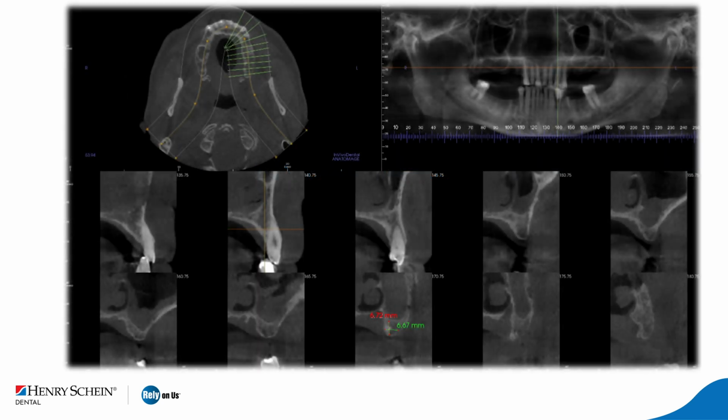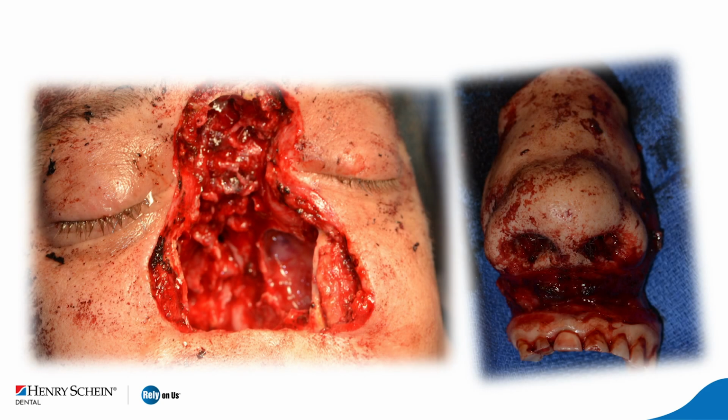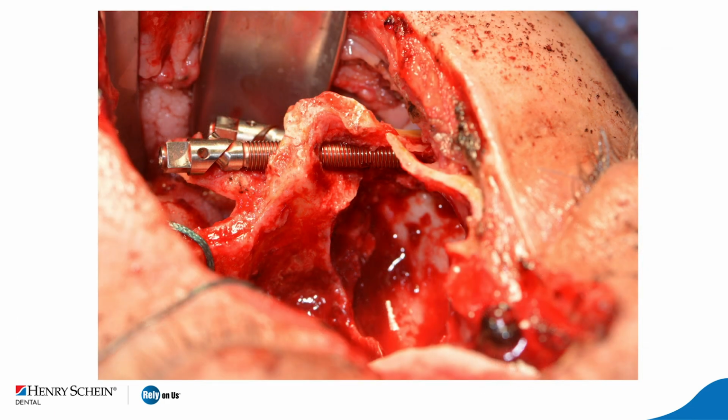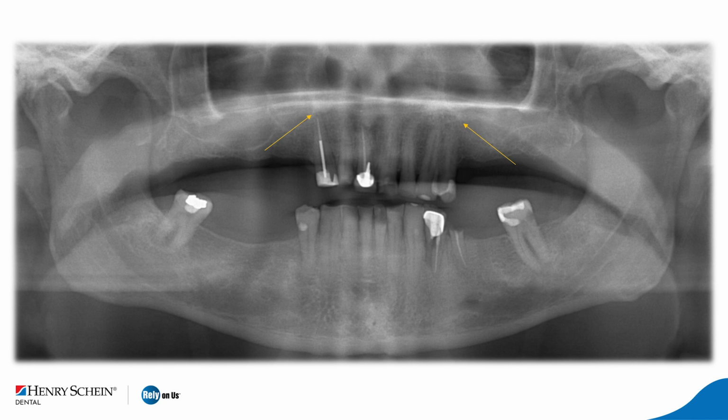And don't feel bad, because as dentists, we are trained and used to look, especially if you're going to place implants. Where's the bone? Where's the floor of my sinus? Where's the mandibular canal? Do I have enough bone? And we look at teeth. Is there any fractured root, or is there decay? That's what our brain guides us to. So it's very important that you look at the whole volume.